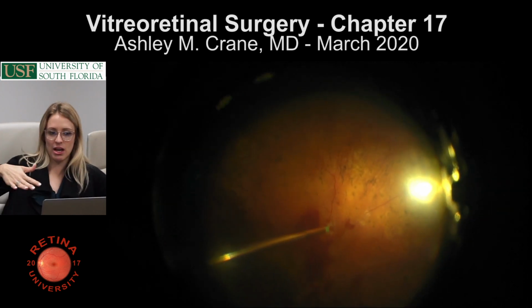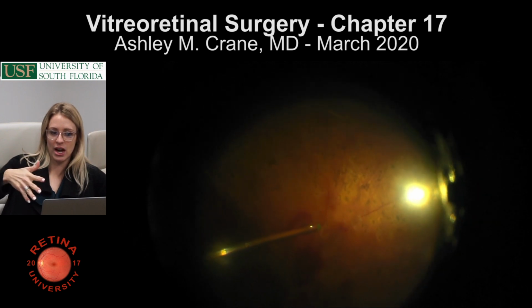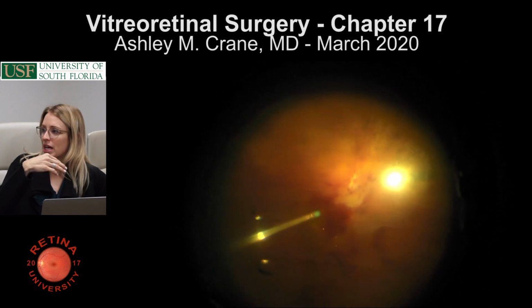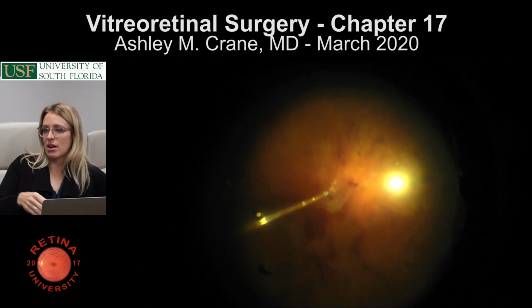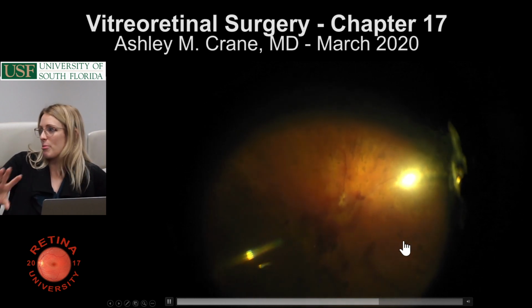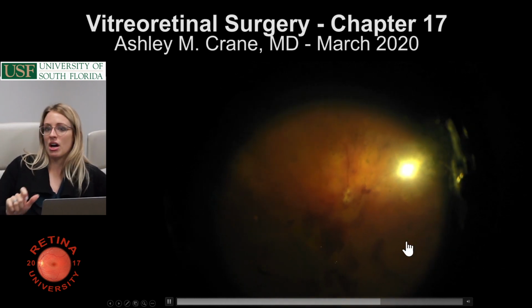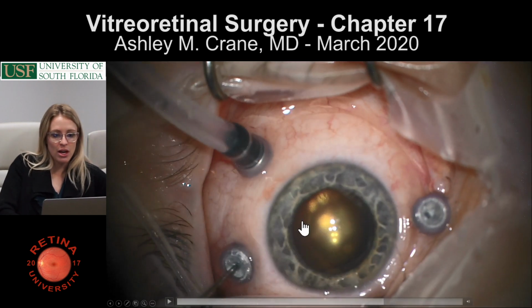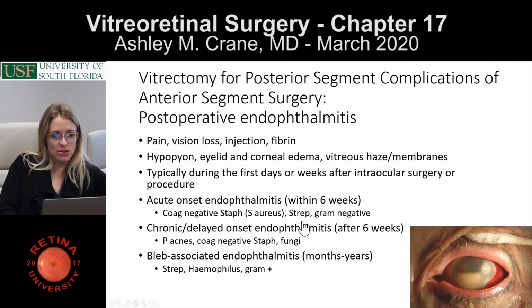So now you have an eye full of air, and then you kind of suck the fluid out from under the retina, and then you exchange that. So that was a fluid air exchange, and then you have an air gas exchange to replace it, though that's not really what we call it. I imagine they use gas in this case. Okay, let's keep going to the next surgery.